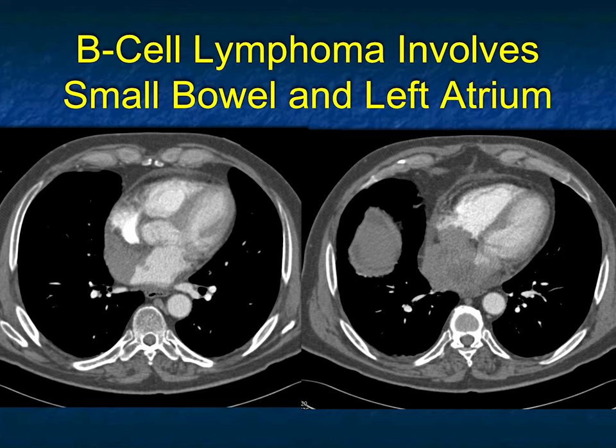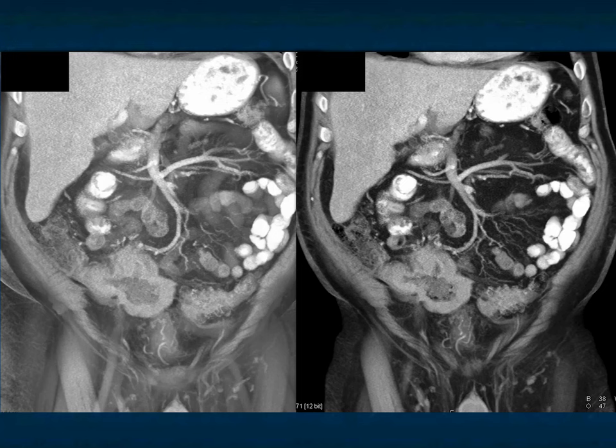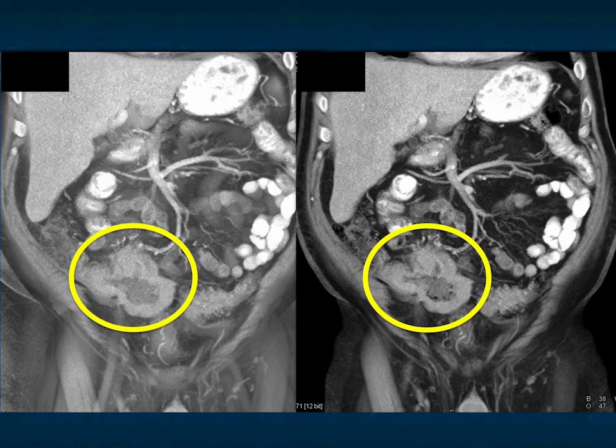When you scan beyond the left and right atria, you can see how impressive the mass is. Scanning downward to the right lower quadrant, there's an ulcerating tumor that looks like lymphoma — lymphoma involving the heart, sometimes primary in the heart and involving bowel secondarily, which was likely the case here. This is a beautiful example of B-cell lymphoma involving the heart with ulceration involving the small bowel.